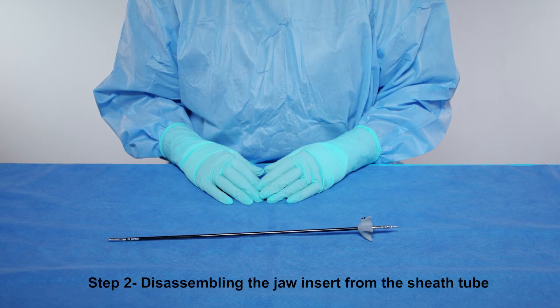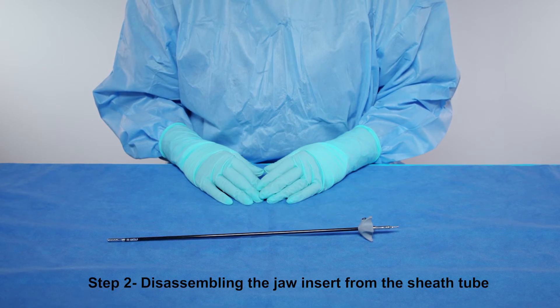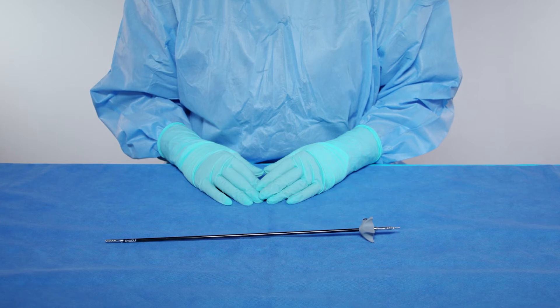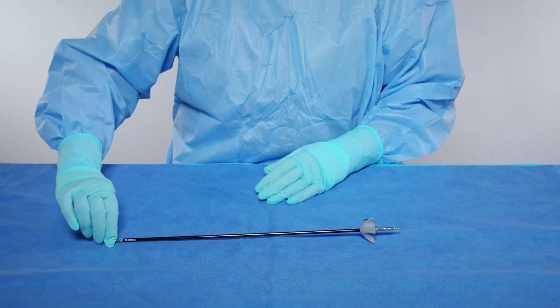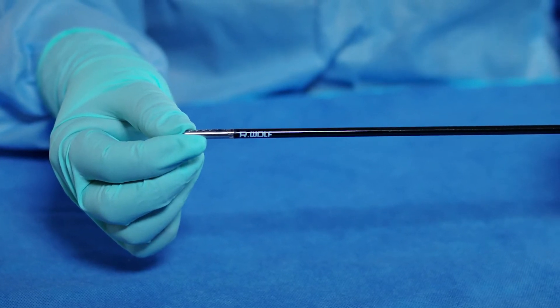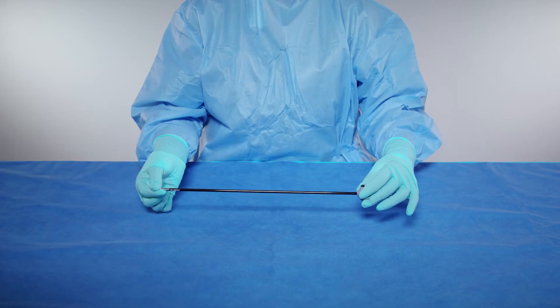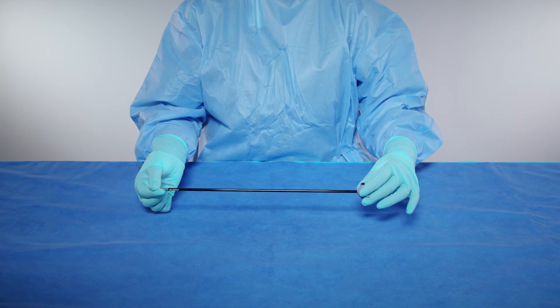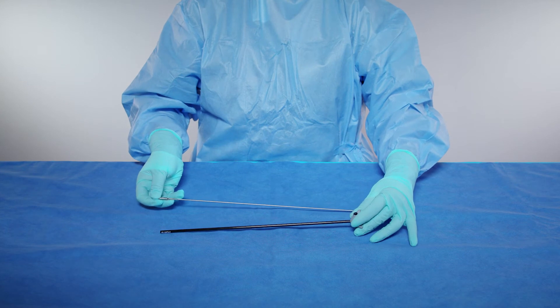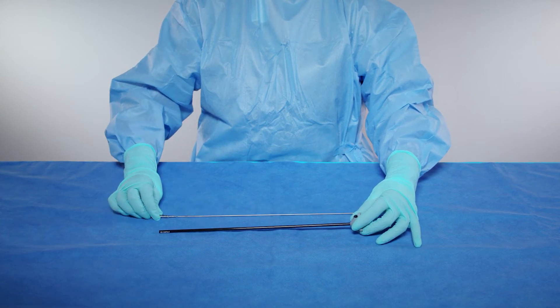Step 2: Disassembling the jaw insert from the sheath tube. With your right hand, gently grasp the tip of the jaw insert and rotate towards you or counterclockwise to uncouple from the sheath tube. Then slide the jaw insert out of the sheath tube. Place both the removed jaw insert and empty sheath tube aside.